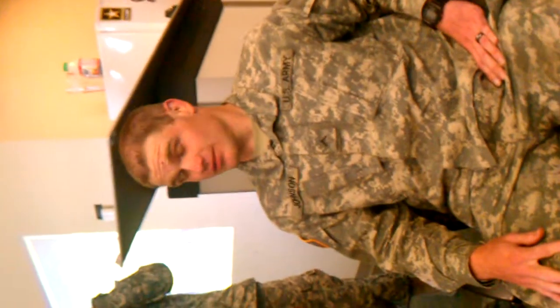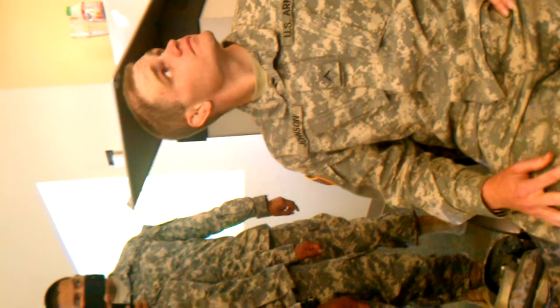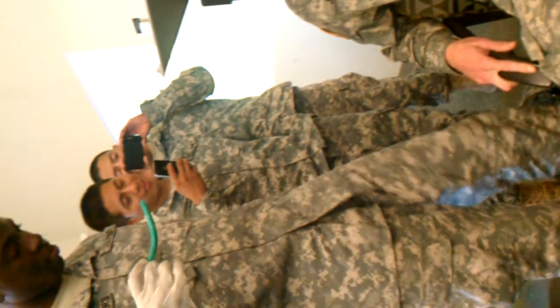This is for educational purposes. Don't go out like a bitch. Do it, Dave. Don't ram that shit in there, be gentle with it. Every single one of y'all, when you're doing this — the reason I have soldiers give it to each other is so you know what it feels like. You don't just go in there and start ramming shit in there. You have, as a medic or as a CLS — a medical giver — you sympathize for this patient and your job is to make them better. Granted, sometimes you have to cause pain to make them better, but it's always done methodically, always done with a purpose. You don't just mess with them to mess with them, even the annoying ones.